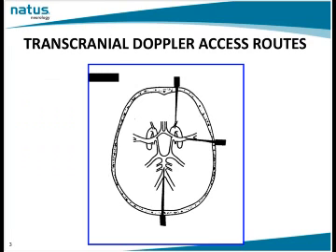So when we talk about a basic TCD, we use three approaches: the transtemporal approach, the transorbital approach, and the suboccipital approach.